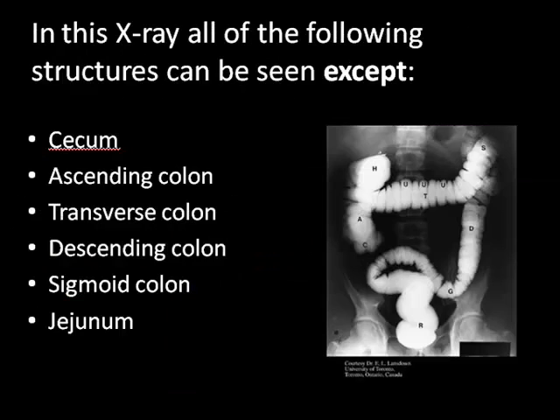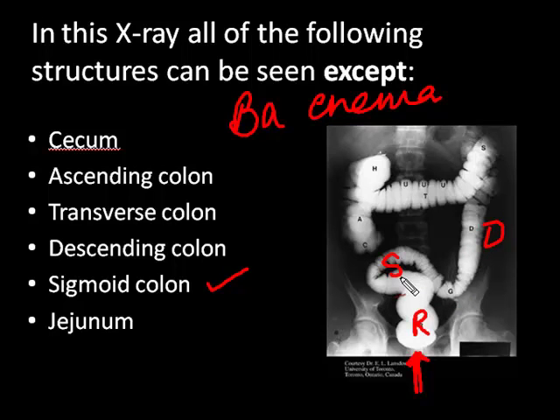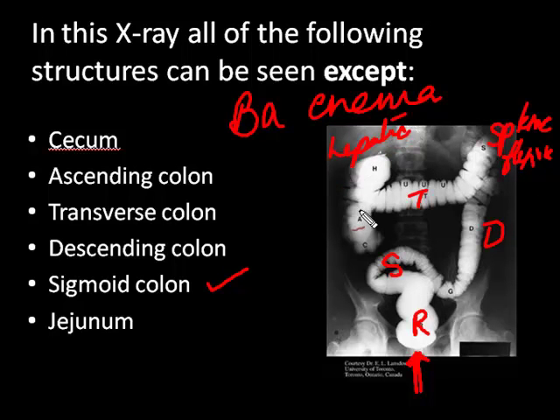The next question asks which of the listed structures is not seen in this x-ray. This is a special x-ray known as a barium enema — enema meaning it's given from below. The dye is pushed in through the anal canal, outlining the rectum, then the sigmoid colon. Passing upward is the descending colon, then the transverse colon. 'S' marks the splenic flexure near the spleen, 'H' marks the hepatic flexure near the liver. Then comes the ascending colon, and finally the dye passes into the cecum.